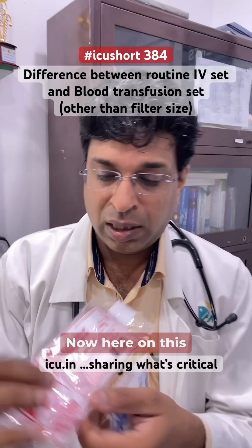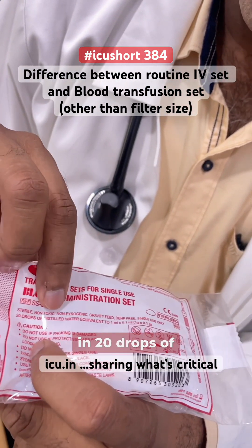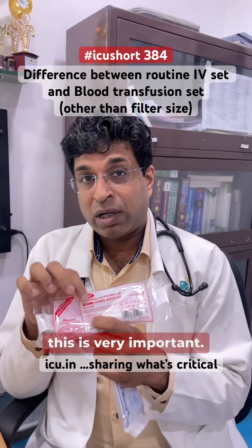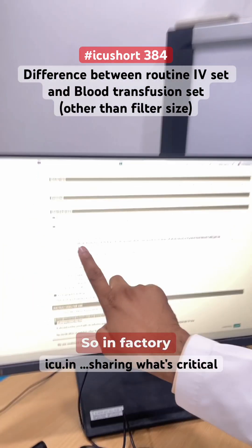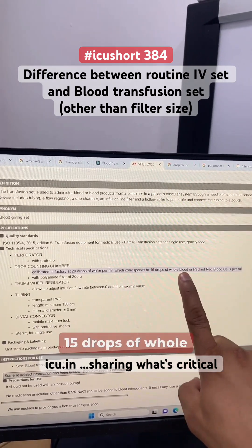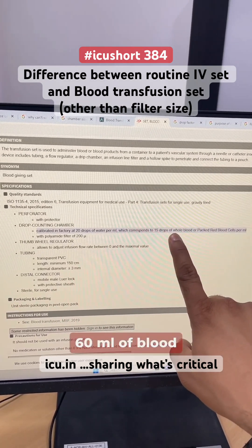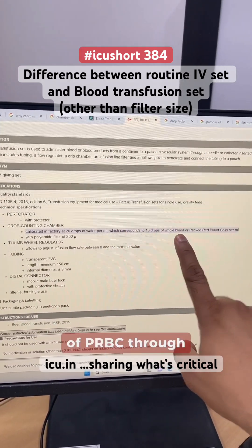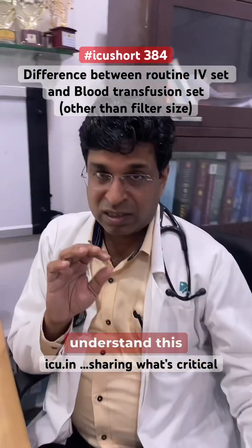On the blood transfusion set, it is also written that 20 drops of distilled water equals 1 ml — but this is very important: it says distilled water. In the factory, sets are calibrated to 20 drops of water per ml, which corresponds to 15 drops of whole blood or packed red blood cells. So if we want to give 60 ml of blood per hour, we need to set it at 15 drops per minute of PRBC. If we give 20 drops, it will run a little faster.